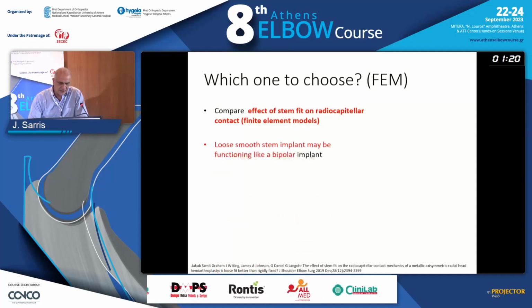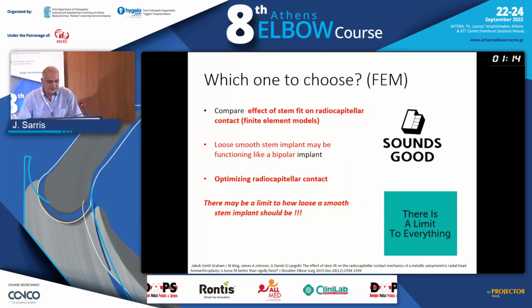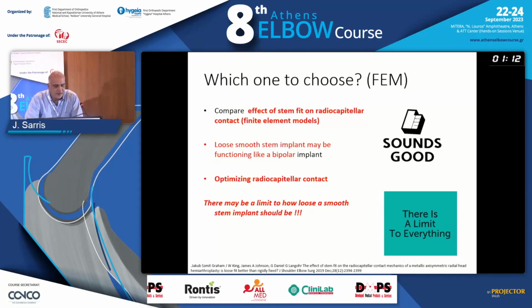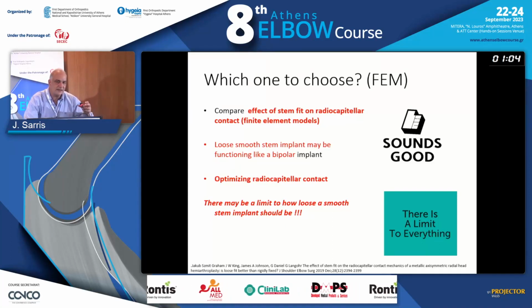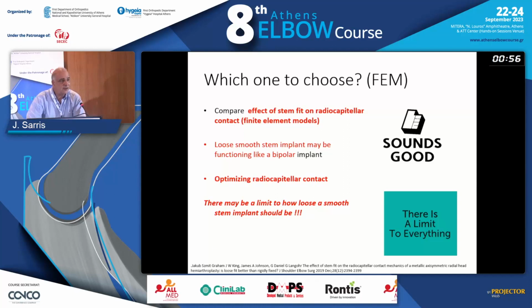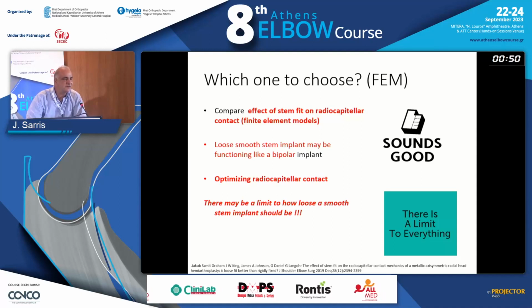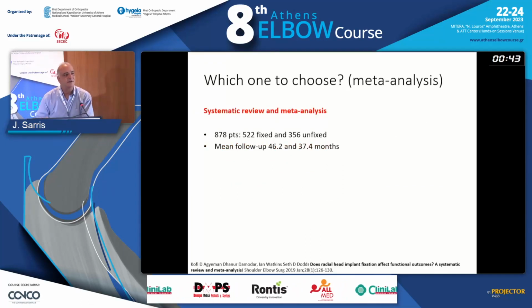So here is a paper from 2019 which compared the effect of the stem in the radiocapitellar contact. And we see that a loose, smooth stem implant may function like a bipolar implant because it moves in the radial canal, so it can take a few angles, optimizing the radiocapitellar contact. But nobody has stated how loose this should be. Should it be 30% of the canal, 20, 10%? Nobody has decided on that, and we need to decide if we say a spacer is the solution.